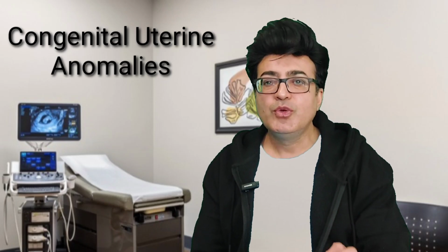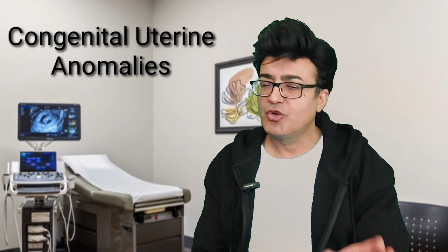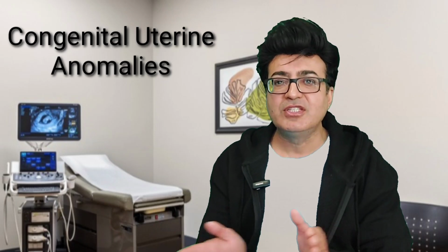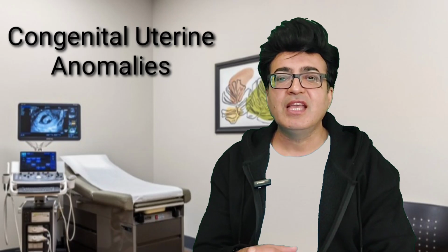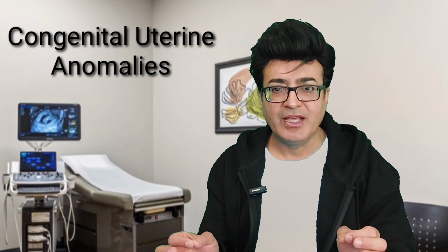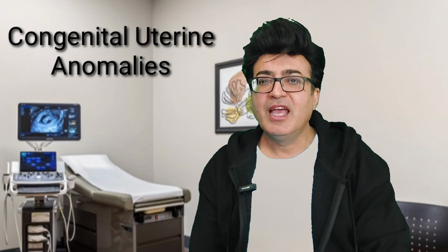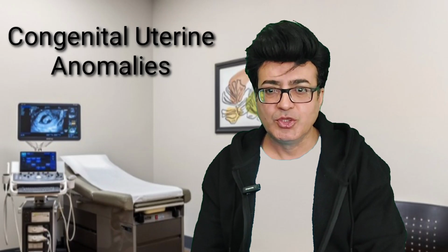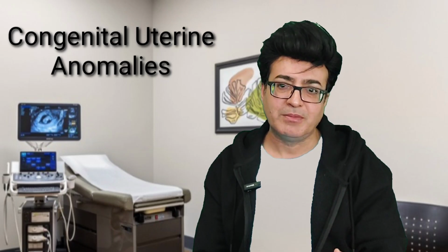The second, you have to look for the thickness of the myometrium. So always look for the myometrial thickness. If there is any discrepancy between the both sides, or if there is any abnormality or thinning, this will definitely show that there is some abnormality. And if you ever come across a septum within it, which is called a septate uterus, always measure the septum. So these are the three parameters.